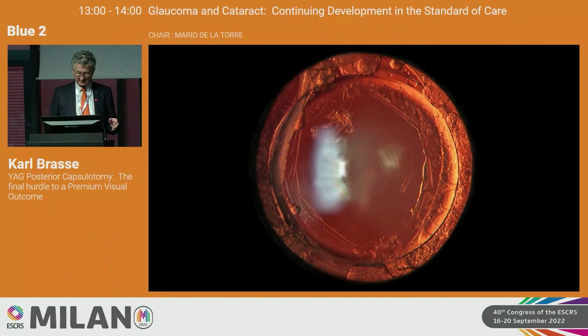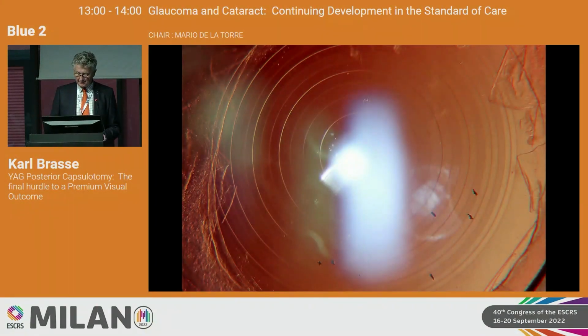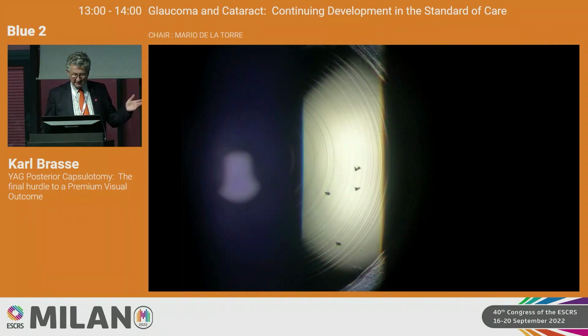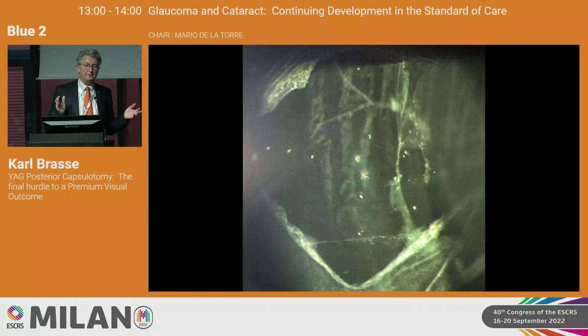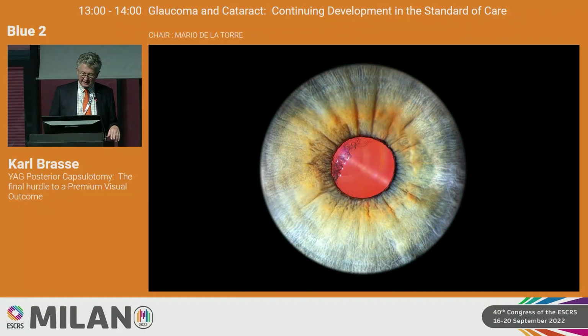These are court cases. This is, for instance, a floater that was done with a circular technique, which can be extremely annoying to patients. And here in particular, you see cases where a contact lens was not used. I don't call that pits, I call that drills. You create drills through the entire IOL. And I think now in these days, where everybody uses digital photography, you might end up in a court case with bad work like this. But you can avoid it easily. I showed you. And let me show you a few more cases.